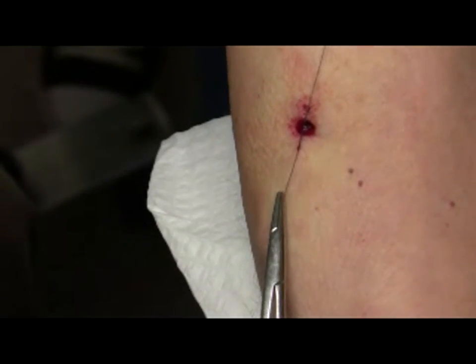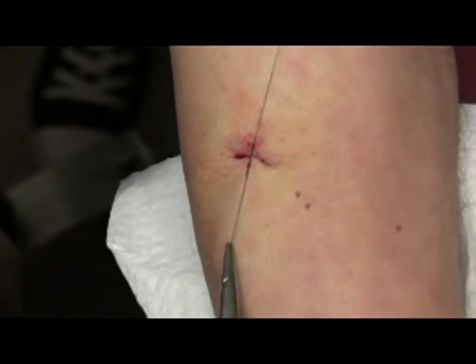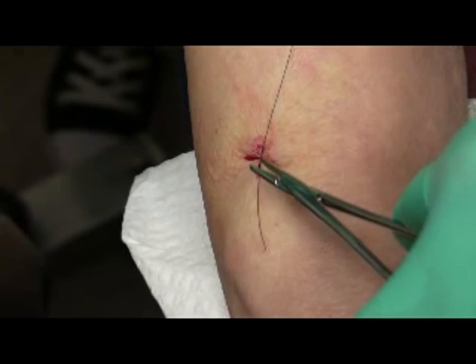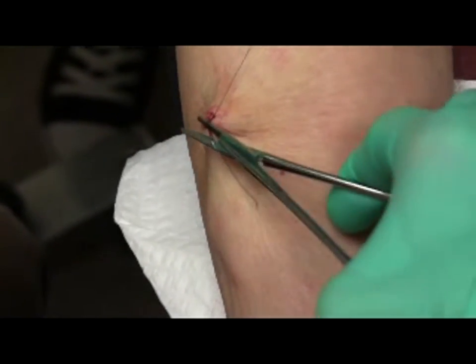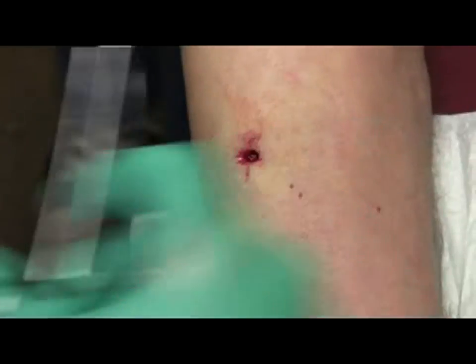Look at how the wound edge is inverting on itself — it's inverting. Skin is touching skin. So this is a bad suture. You have to know when to undo it and redo it.